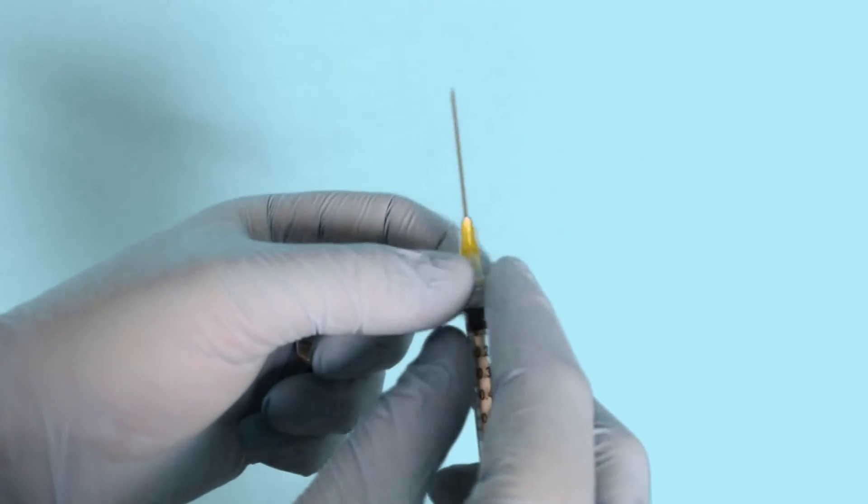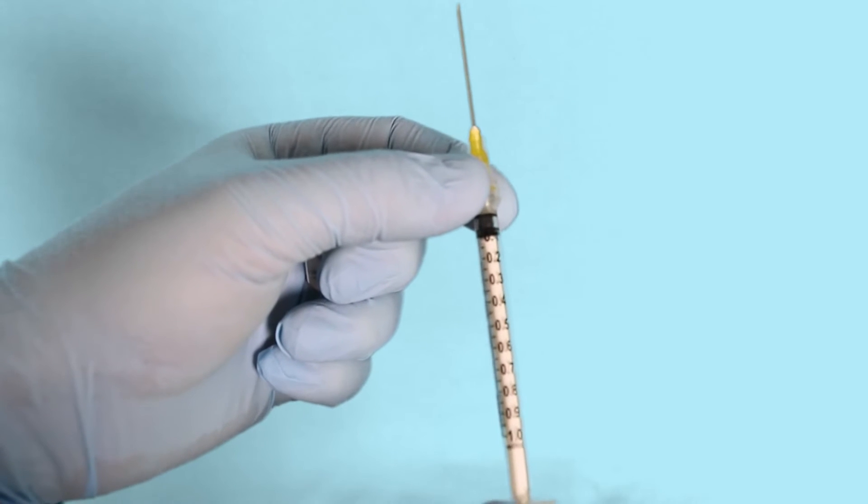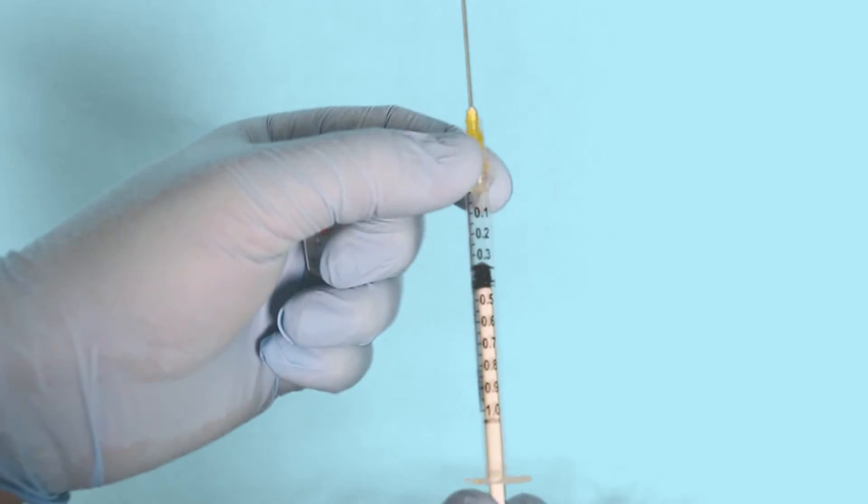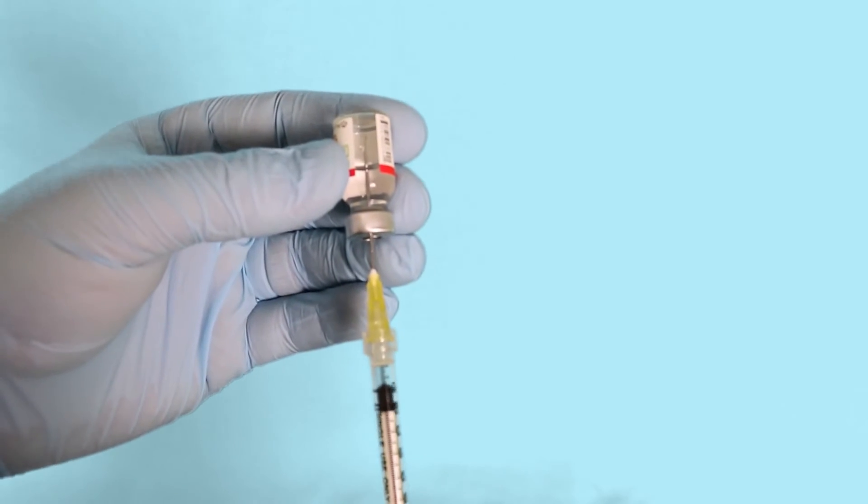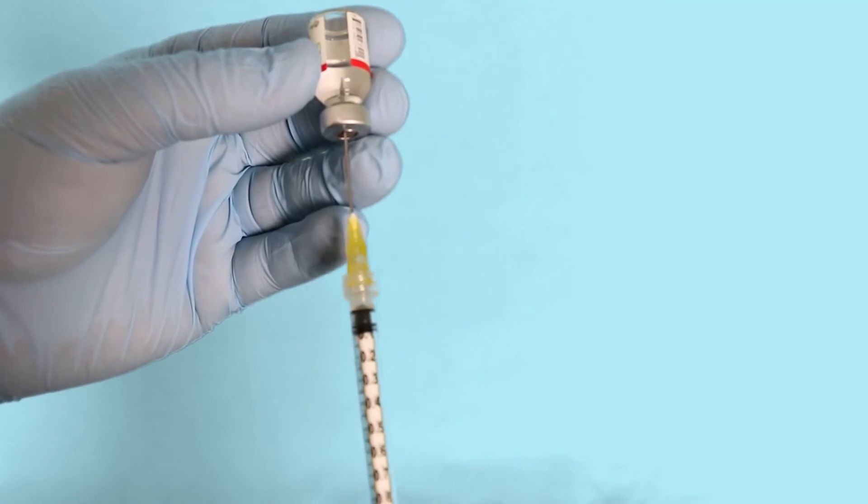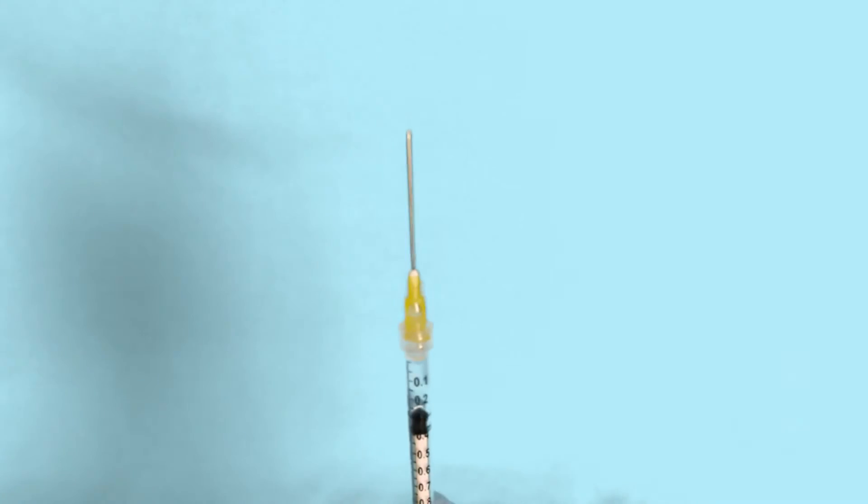The adult epinephrine autoinjector dose is 0.3 mg, so in this case we will draw up 0.3 ml of air before injecting it into the empty space above the fluid line. Then draw up your intended dose. Lastly, make sure you express any air before administering an injection.